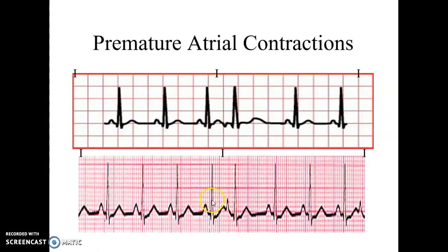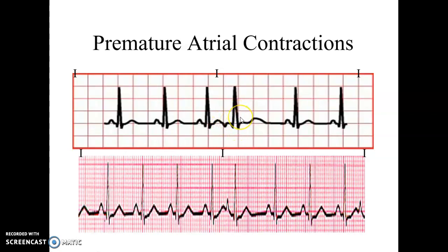On this top example, I've got a regular spacing for the first three beats, and then the fourth beat comes in early and is premature with a little time lag after it, and then I go back to my normal spacing. The normal beats are regularly spaced with a P wave for each QRS. In the first three seconds, my rate is 60. PR interval, QRS, and QT look okay — so it looks like a sinus rhythm. Then I have this beat that fires early — it's premature — with an upside-down P wave but a normal PR interval measurement. QRS doesn't really change. So it looks like I have a PAC, a premature atrial contraction, with a time lag after it. I would chart this as sinus rhythm at 60 with one PAC.